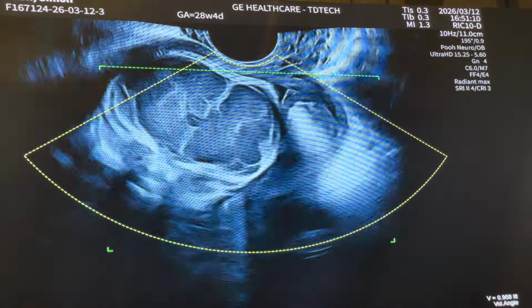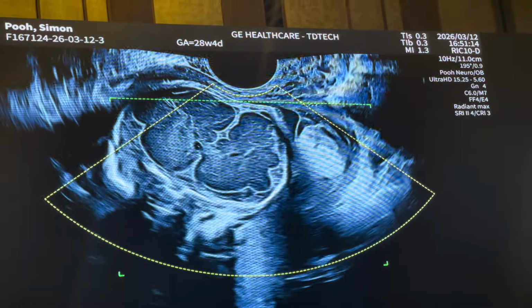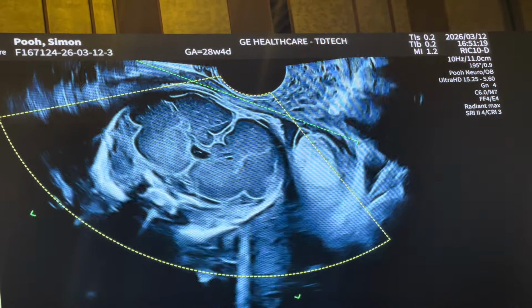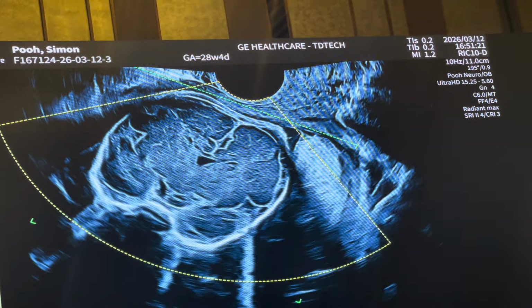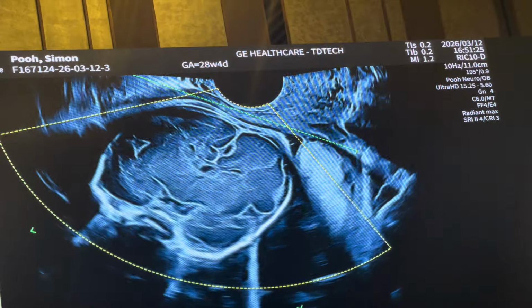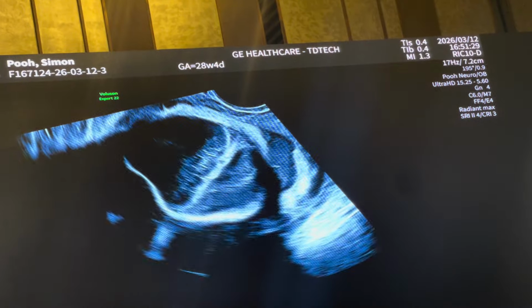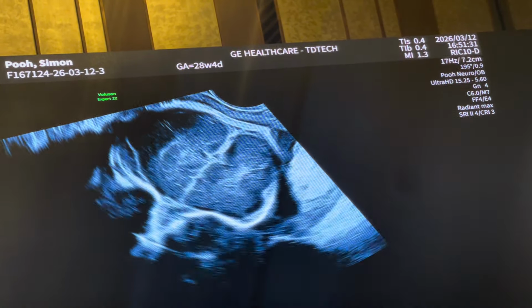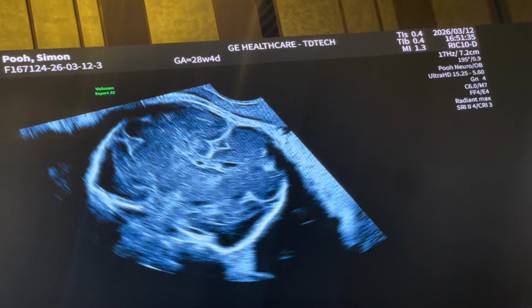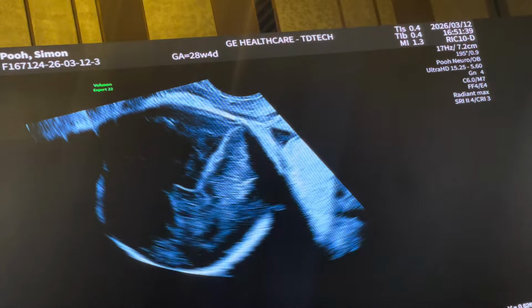So we're looking at doing a 3D volume, and I'm waiting for Ritsuko's instructions. I'm going to select a wide region of interest, exactly where the baby's head is. I'm setting the quality to max. The volume angle is taken down to 80, and now we're acquiring. Hold your breath please, 5, 4, 3, 2, 1. Breathe away normally.